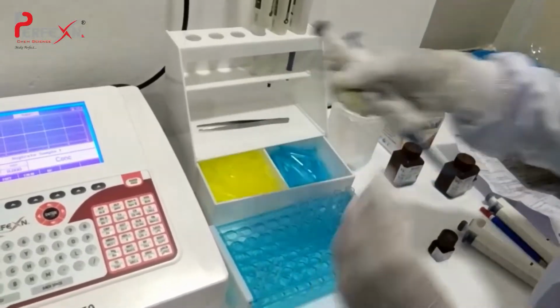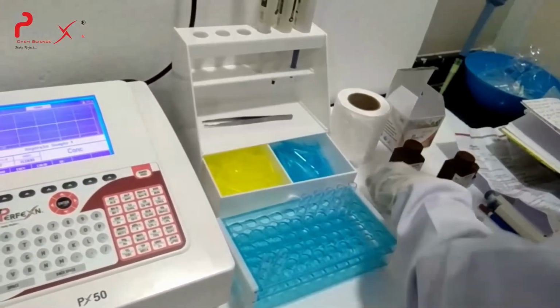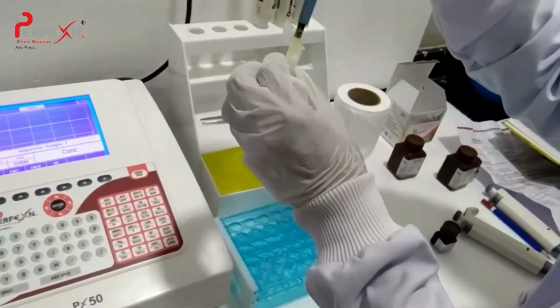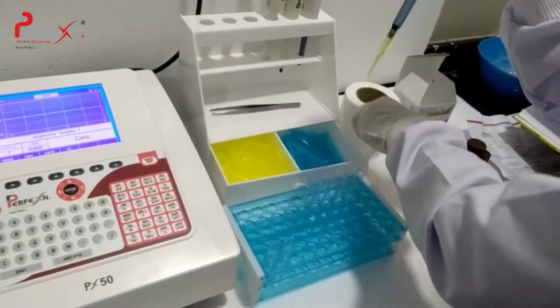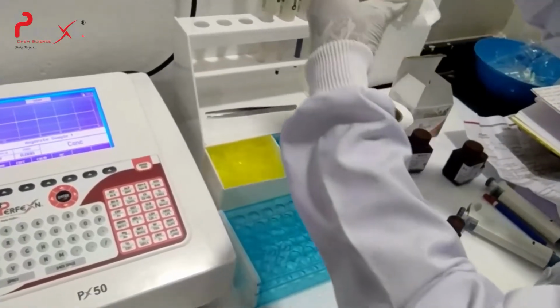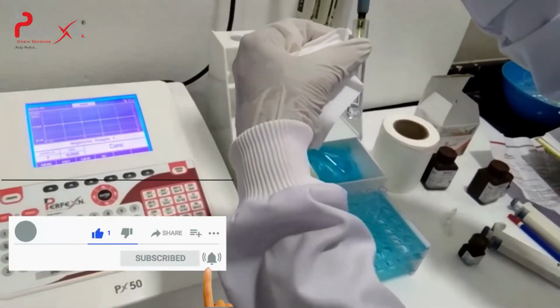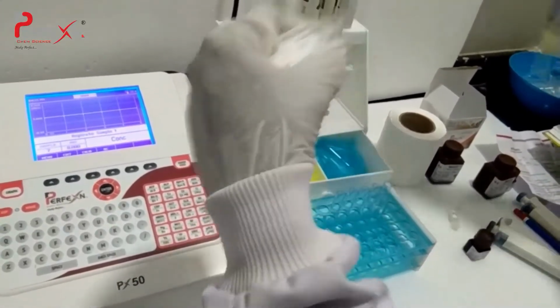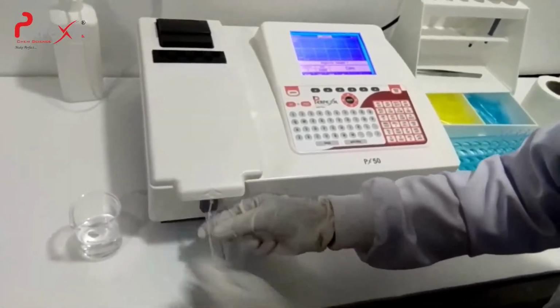The sample requirement for this half ratio procedure is 50 microliter. I am taking the biochemistry control level 1, and I have to pour it into the reagent tube, wipe off the excess sample, mix it well in the test tube of R1 and R2, and proceed for the test.